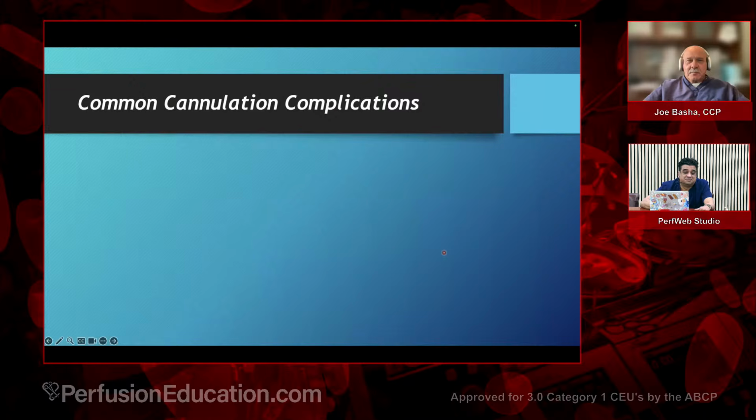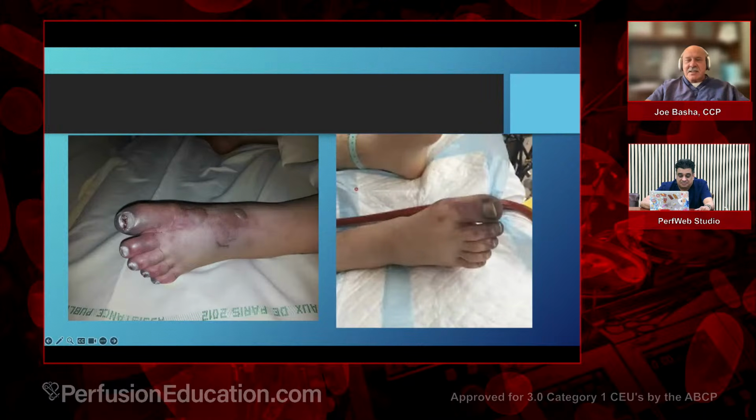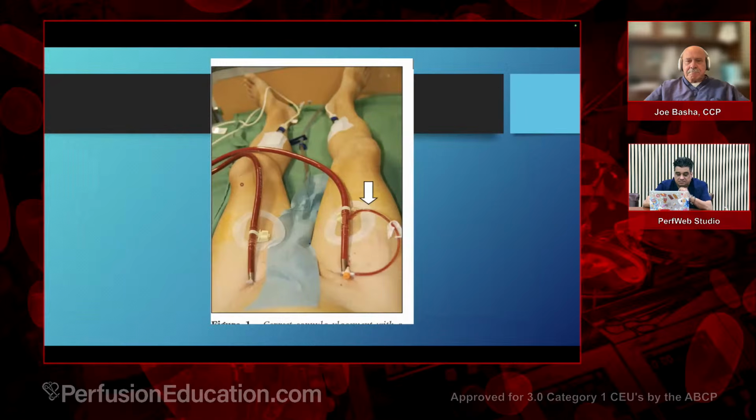There you go. Common cannula complications. This is what poor perfusion looks like. You don't put an SFA line in, or worse, you do what somebody I saw do, and you put an SFA line in that's not in anything and infiltrated, and oh my God, fasciotomies, and we lost that leg. They lost the patient too, but this is what it looks like when you don't do an SFA line, and you have no distal or very poor distal perfusion to the limbs.